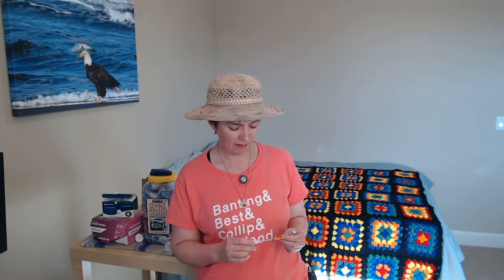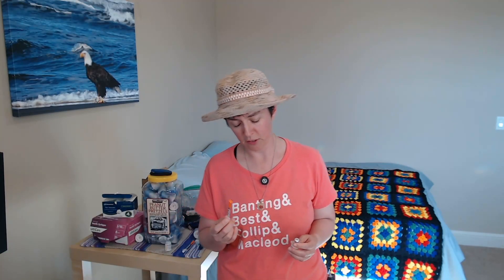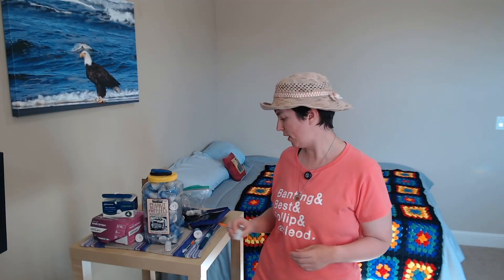This syringe is more appropriately sized because this one only holds 30 units, so I can dose a few units out of this one. When I later saw an endocrinologist, she quickly spotted the error and prescribed syringes that were the correct size for the amount of insulin I needed to dose. I also started using insulin pens instead of insulin syringes, which are way more convenient.